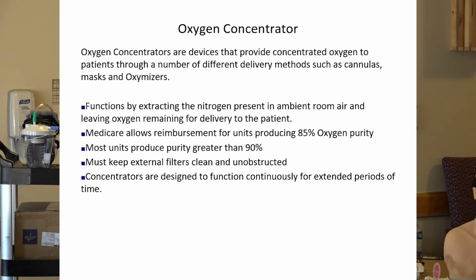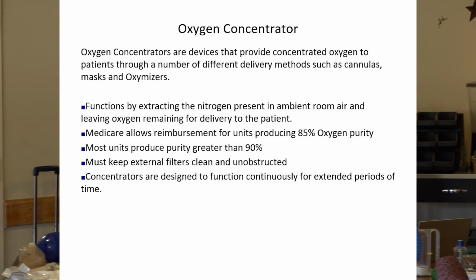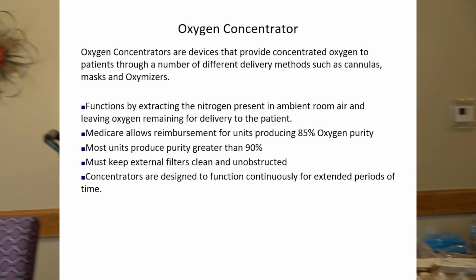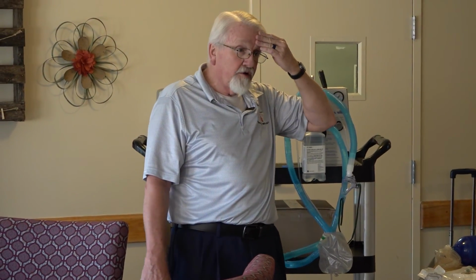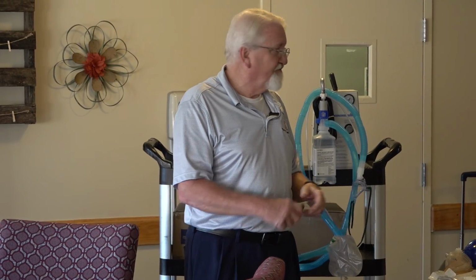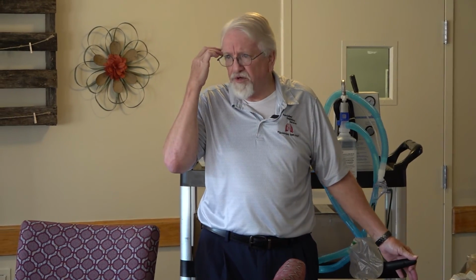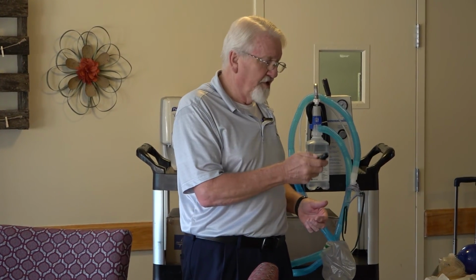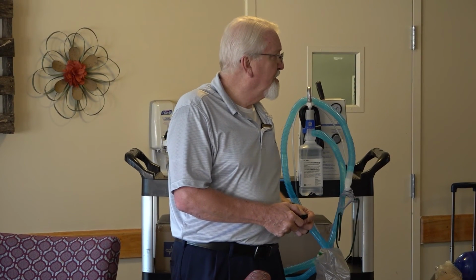Let's see, concentrators. Basically what it's doing is filtering nitrogen out of the air that it's bringing in from the back. You want to make sure that filter stays clean. Typically, whoever your provider is, your DME provider, is going to watch all that, but you need to be aware of that as well, that those filters need to be clean.